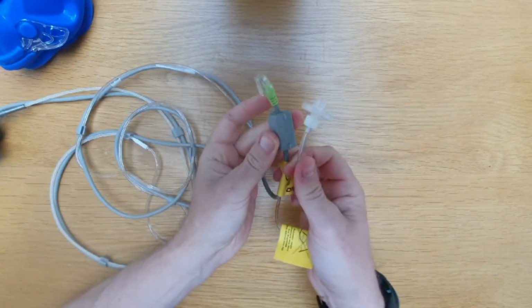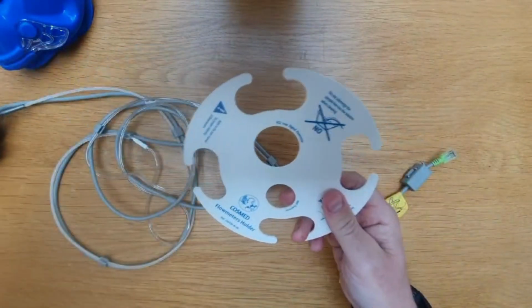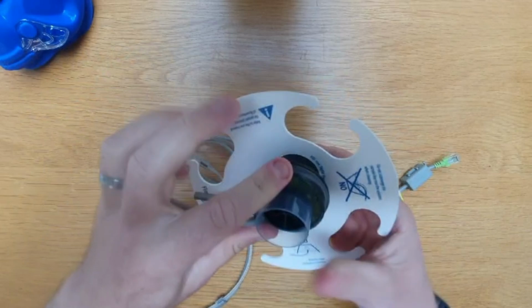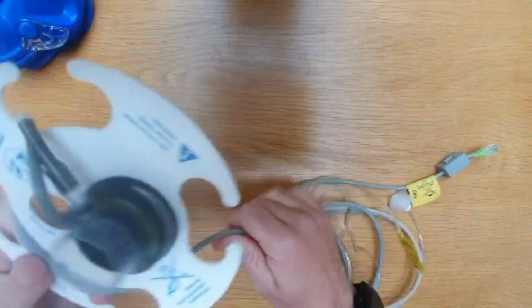Once this is done, you can reconnect the PermaPure and flow meter to the Fitmate Pro for testing. Or securely wrap the PermaPure and flow meter around the storage disc to keep it safe between tests.